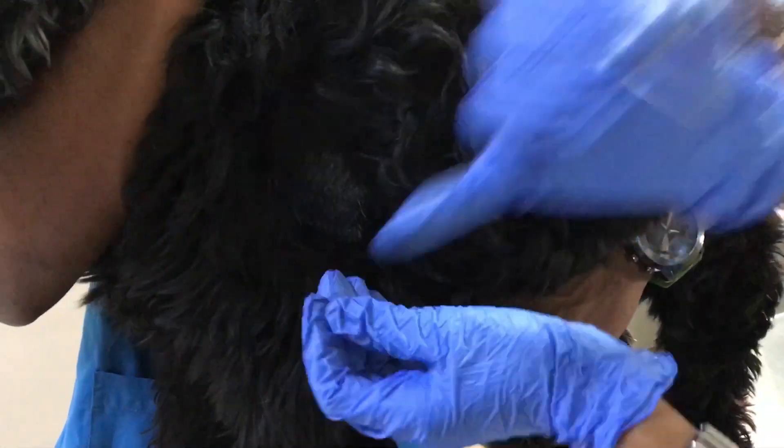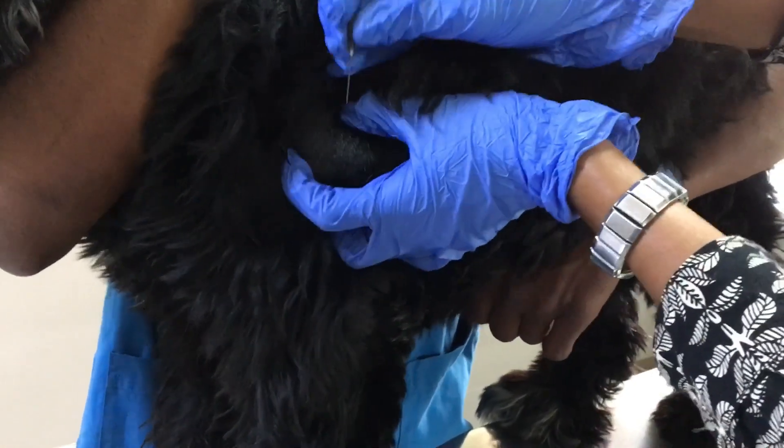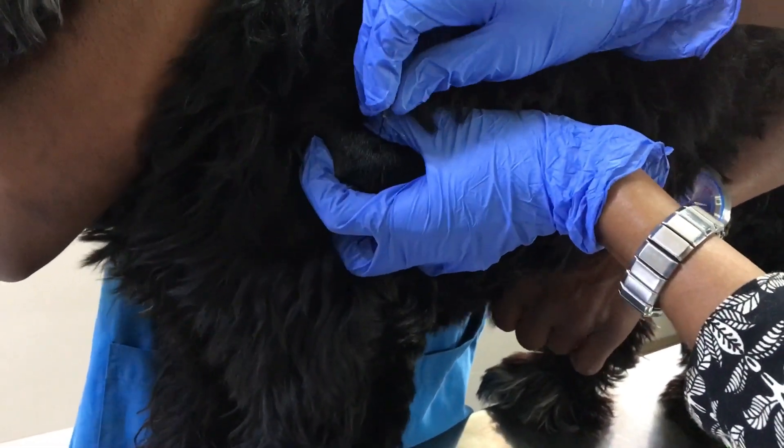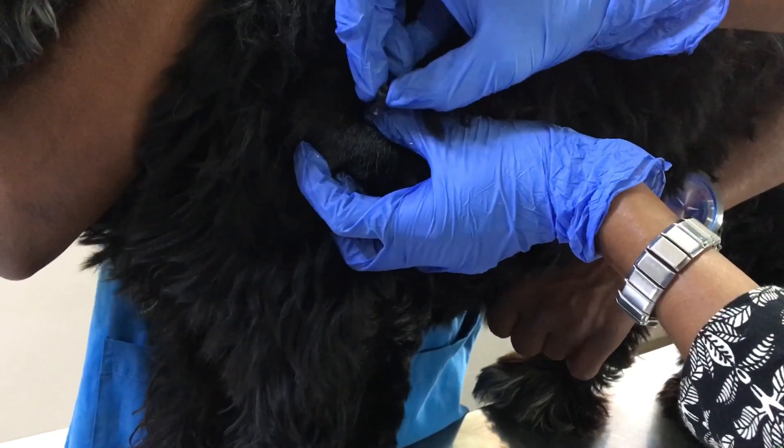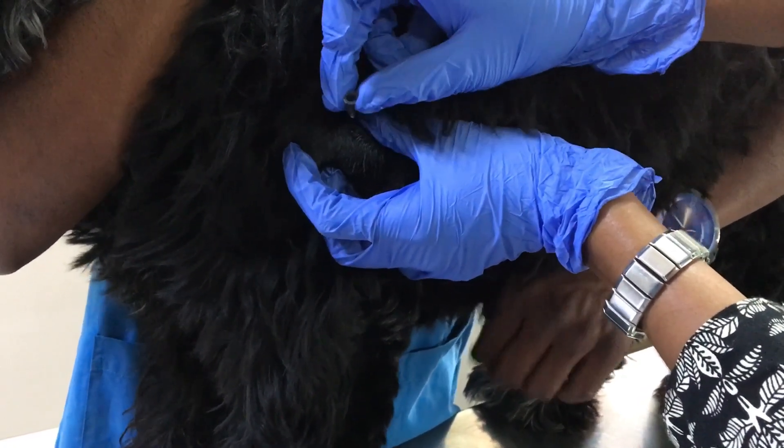Once it is sterile, I am going to poke the needle on the tumor site and perform this action several times. This action is quite similar to the woodpecker.